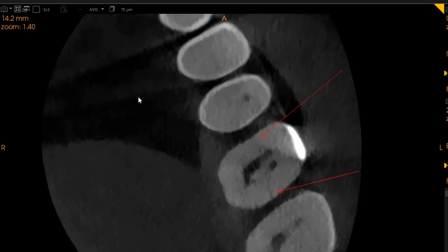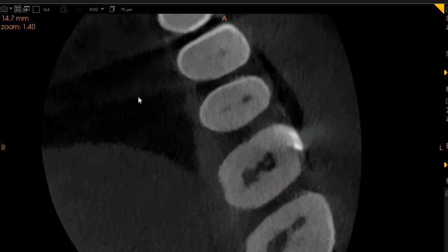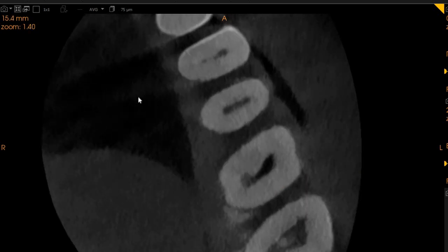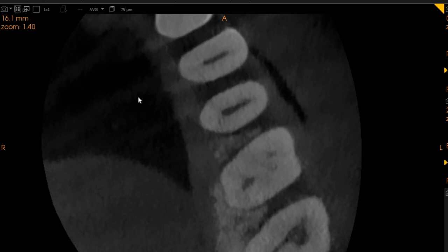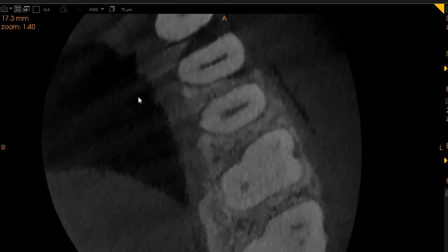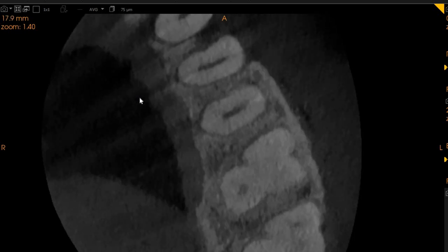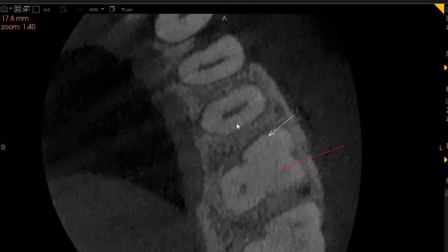Moving further down towards the apex, we can also see there is a slight crack line right here in the same area, extending right here as well. Along with this, we see PDL widening here, which is confirmatory when it comes to the crack extending in the crestal areas of the bony regions.